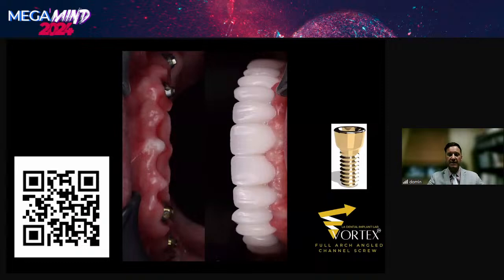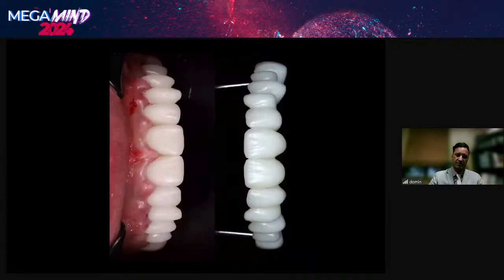In fact, I took the final photo, and when I went back to look at before and after, I was blown away at the results. But this is typical of what you should see in cases that come in with failing dentition, knowing what the end in mind should be like. Not every case is an FP3 case. Many cases that we perform are FP1 cases, but in these particular cases, it's really important to sculpt the soft tissue profile in the provisionals.